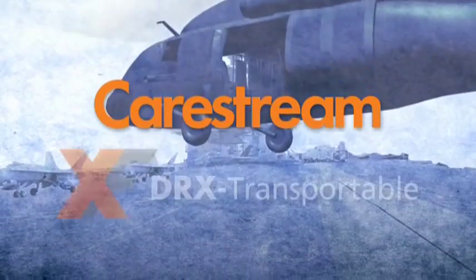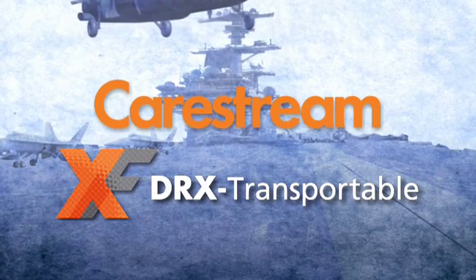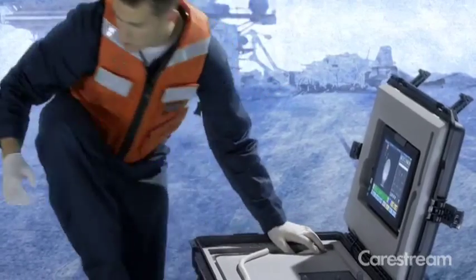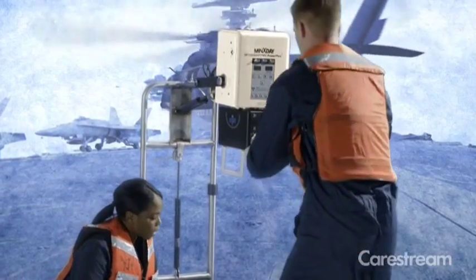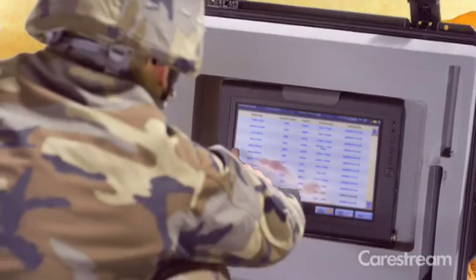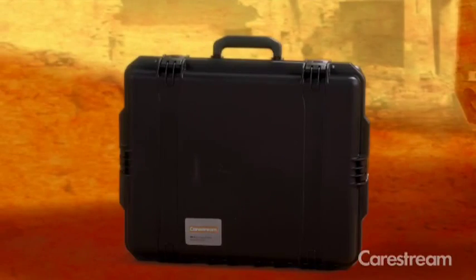CareStream is dedicated to the X-Ray market and providing unique wireless DR detector solutions with the end user in mind. Our focus isn't only hospitals or clinics, but also people working in remote locations and in extreme environments. The CareStream X-Factor thinking lets you take the DRX detector to the field.